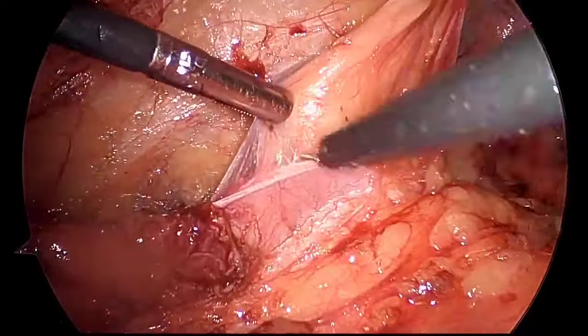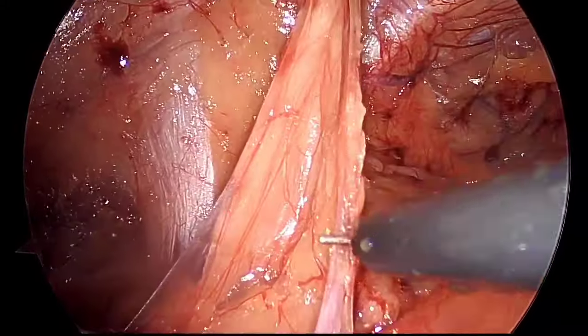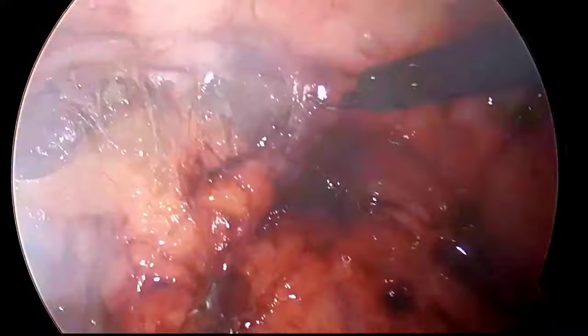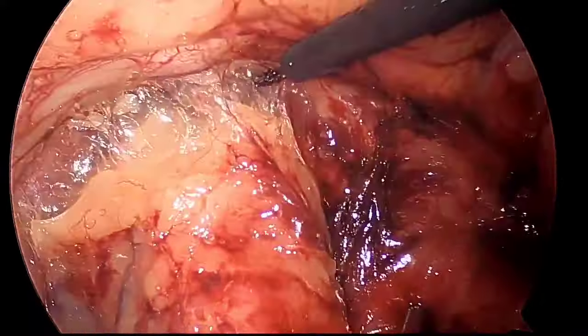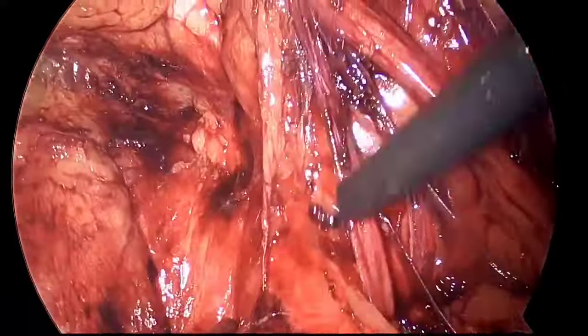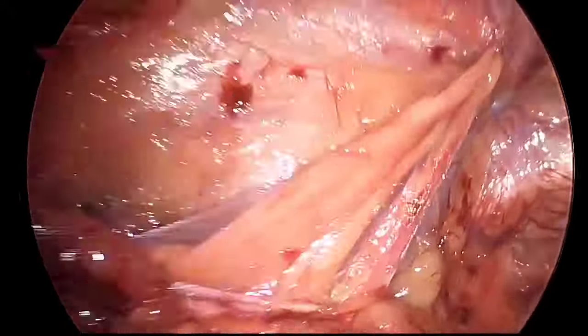And you can see, at least from the defect margin the sac should come down at least 5 to 6 centimeter. And now medially in the midline the preperitoneal fat is exposed, so that I can expose the symphysis pubis, and I can go beyond that, so that at least 2 to 3 centimeter below the Cooper's ligament I can expose. Finally checking for the hemostasis. So the complete dissection has been done.